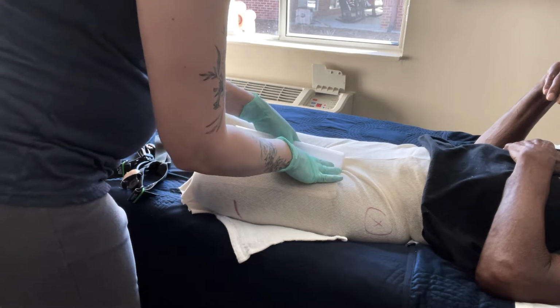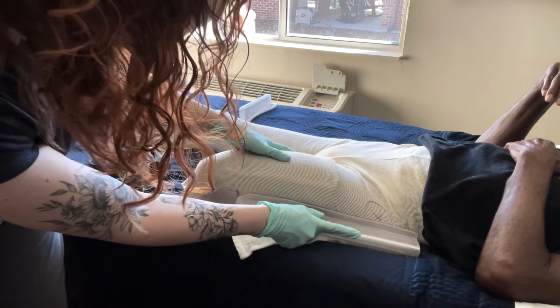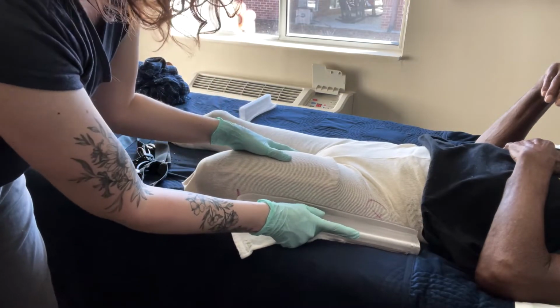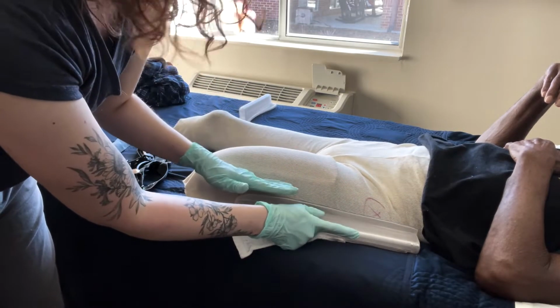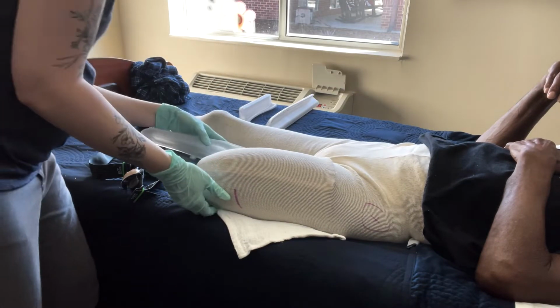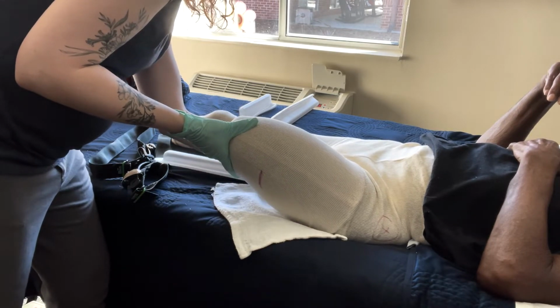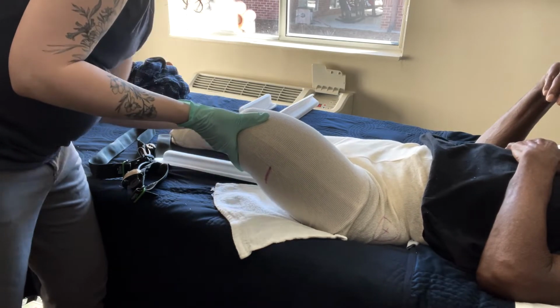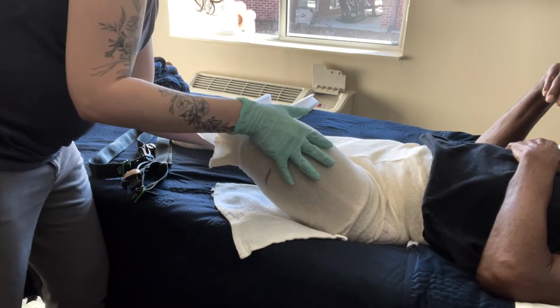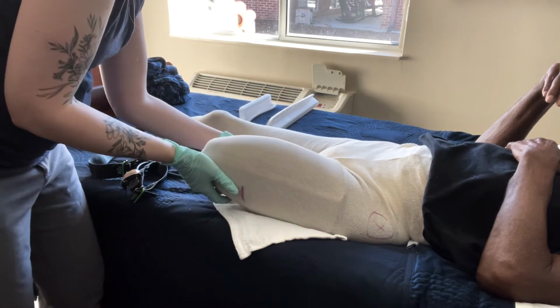So we've got one in the front right here. We're going to have one in the side right here. And that basically just helps support that long bone in there. And then you're going to have one right below, so lift up for me, that bone that I was feeling for earlier. That one's going to go right underneath. And then those straps help hold everything together.